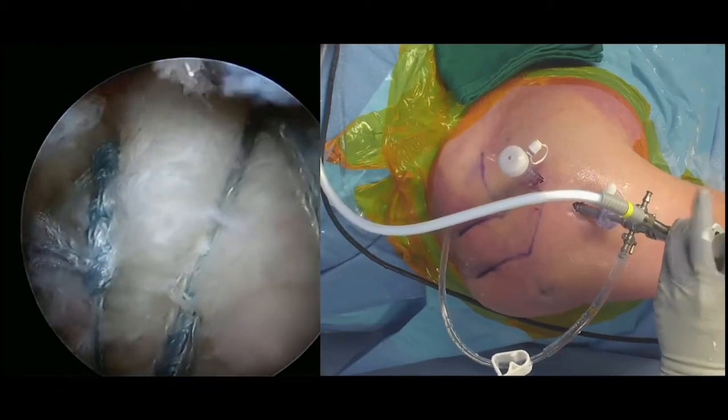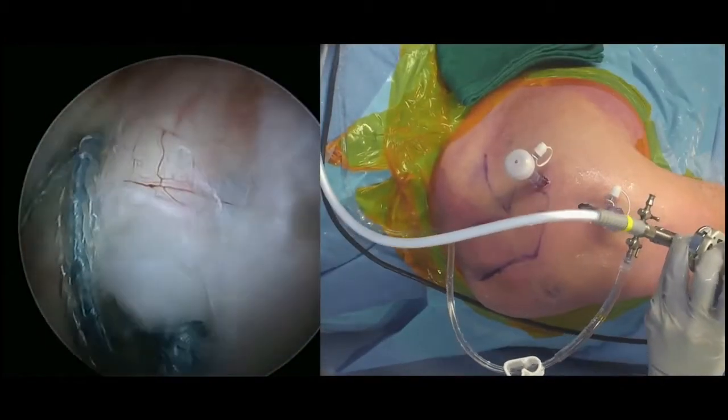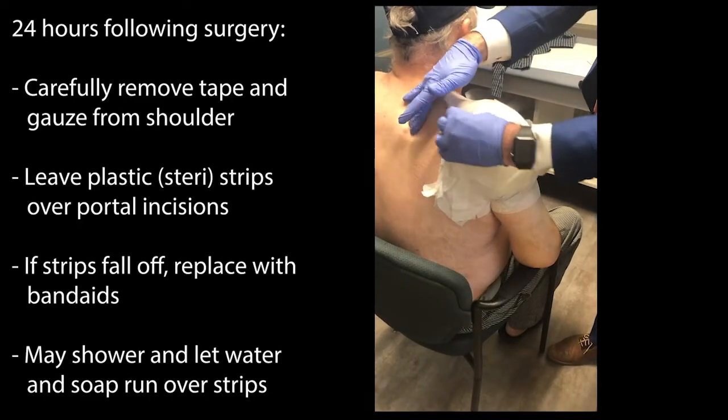As you can see in the video, there's a lot of fluid that's pumped into the shoulder through the end of the scope while we're working, and this takes some time to go down after surgery.